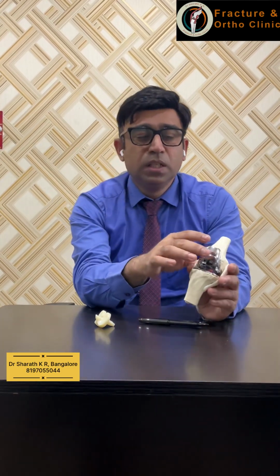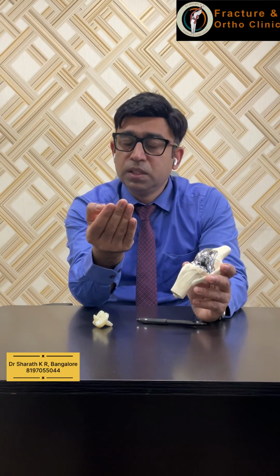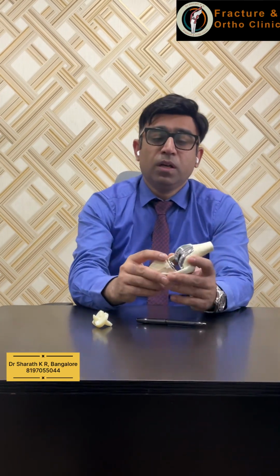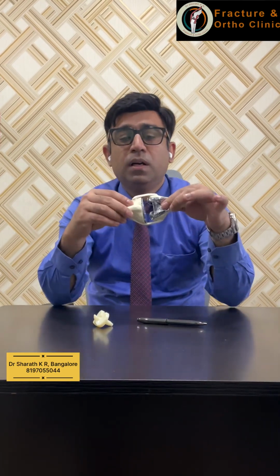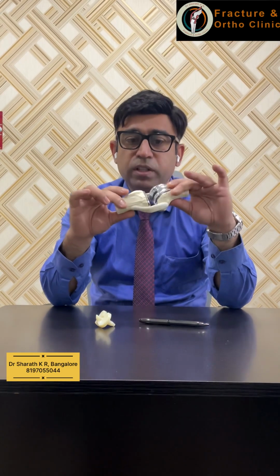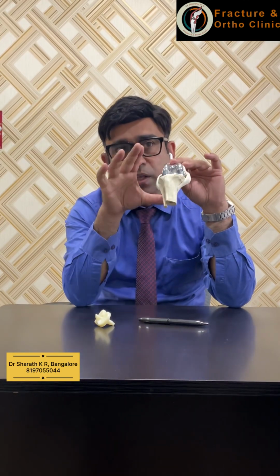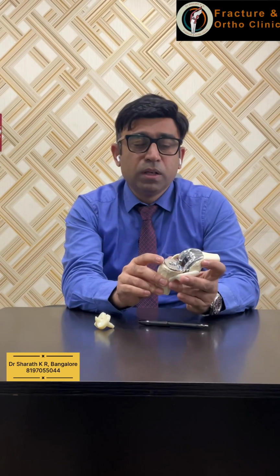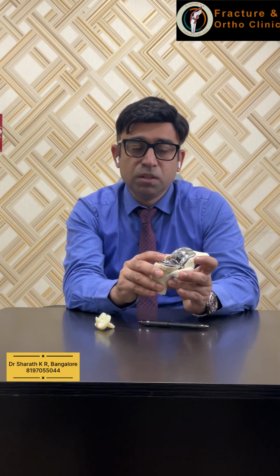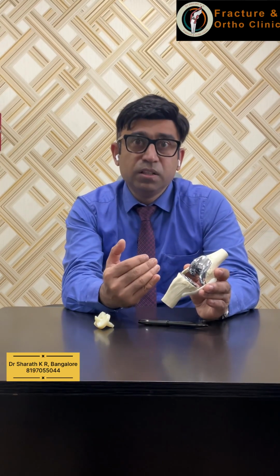The result of this fine tuning of the resection of the bone, how it translates into clinical results, is that we are interested in making this gap as rectangular as possible when the knee is kept in a straight position and when the knee is kept in a bent position of 90-degree bending. When we see it from the front when the knee is bent, this is called the flexion gap, and this is called the extension gap. We are not resecting or releasing so many soft tissues, and this makes the surgery less invasive and more precise.